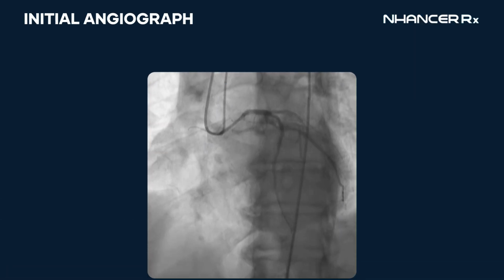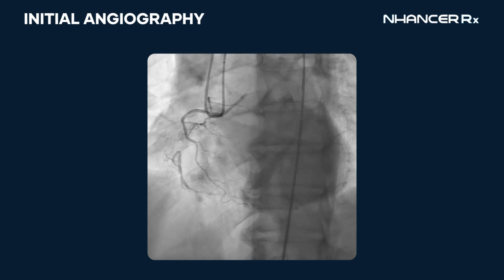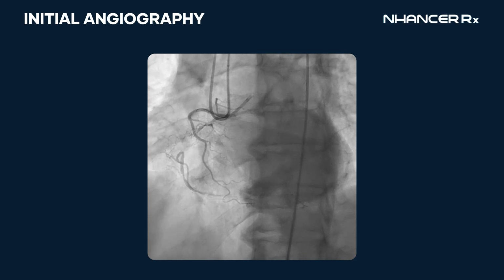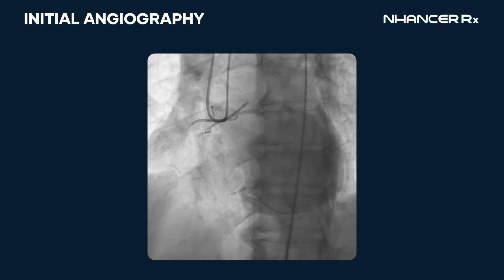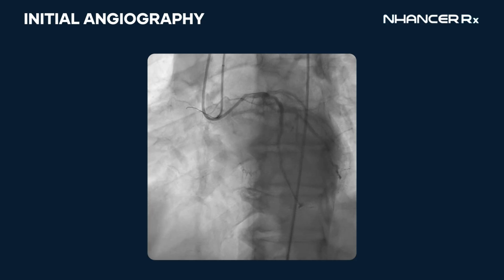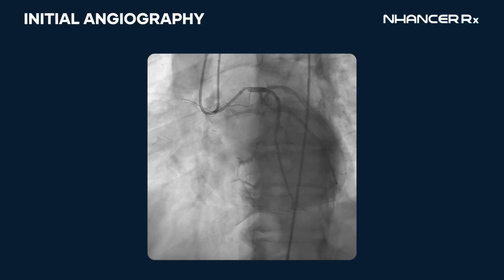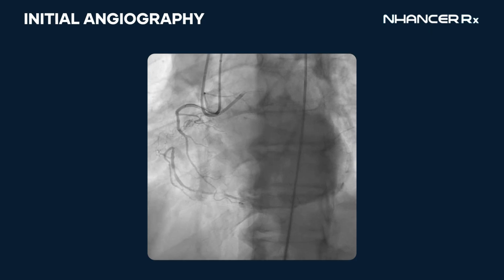What you can see is the initial dual injection angiography for our CTO setup. You can see that there is a prox to mid RCA CTO, and that is being supplied by some left to right collaterals, predominantly from a very tortuous epicardial off the circumflex. This made a retrograde approach very challenging and with limited options. Antegrade, there was some ambiguity at the proximal cap, and likely not a successful antegrade wire case either.